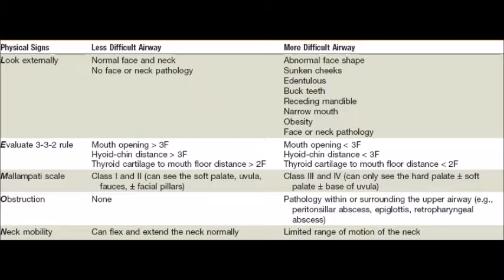Today I'm making an exemplar video on laryngoscopy as part of the assessments for PAR 4430. There'll be several parts of the presentation. First I'll introduce an acronym, the LEMON acronym for assessing a patient airway. Then we'll go through the actual physical process of laryngoscopy, including preparation of the equipment and the laryngoscopy procedure.